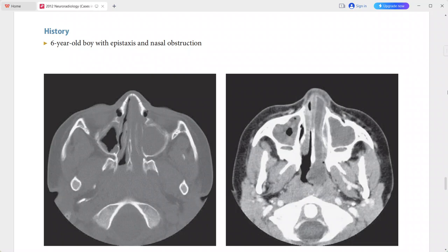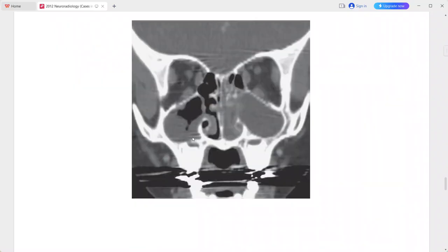This is a case of a six-year-old boy who presented with epistaxis and nasal obstruction. On the axial CT scan, there is complete opacification of the left maxillary sinus and a lobular mass which is extending into the nasal cavity and nasopharynx.